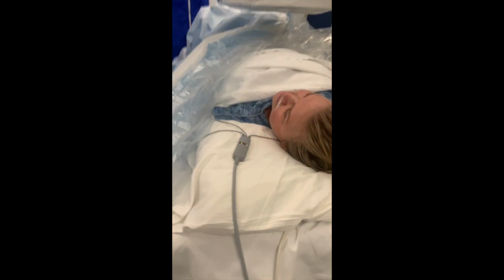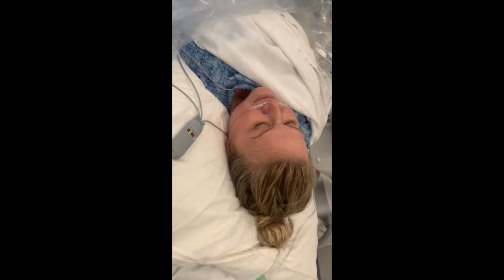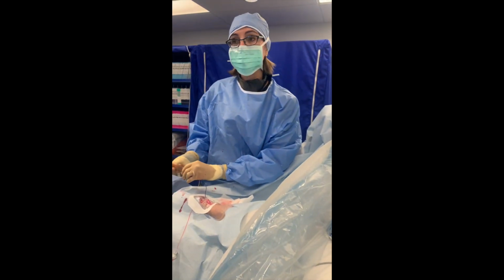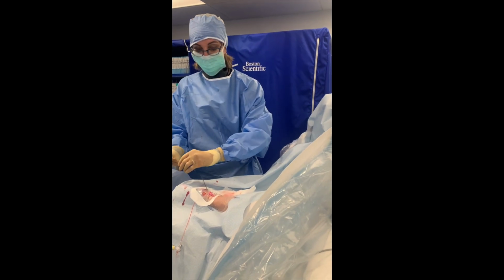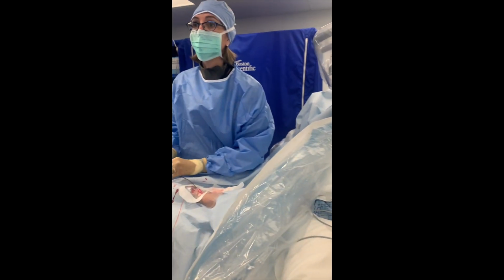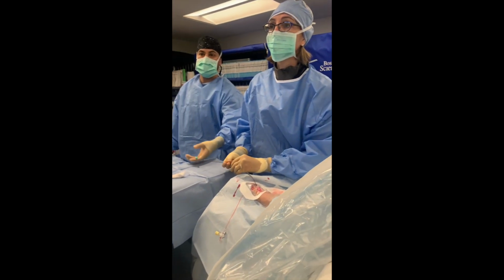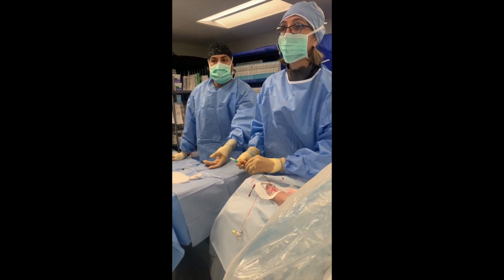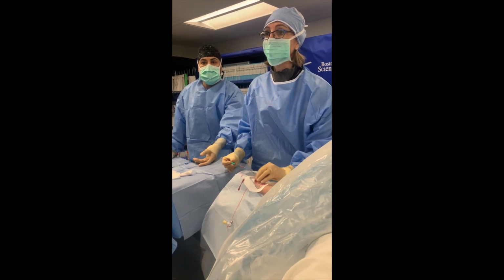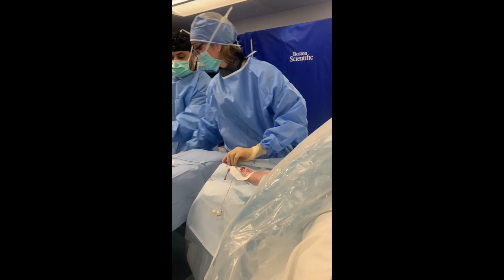Okay, so that's the external. So I know that we don't have nerve endings, but it is odd. I don't feel a thing. You don't feel pain? You don't feel warmth in your pelvis with the injection? Okay. Sometimes you feel like you have to pee, or like you're going to wet yourself, but you don't. It's just the warmth of the dye. A lot of people get real funny with that. I think because you're nice and relaxed, and that makes all the difference in this procedure.